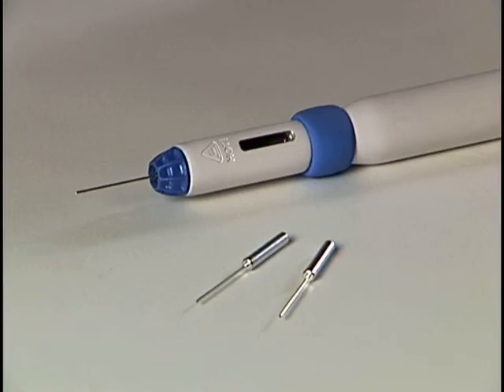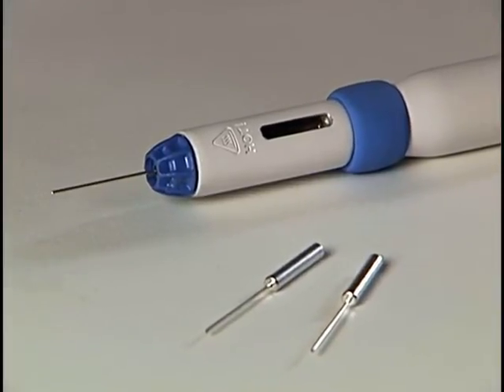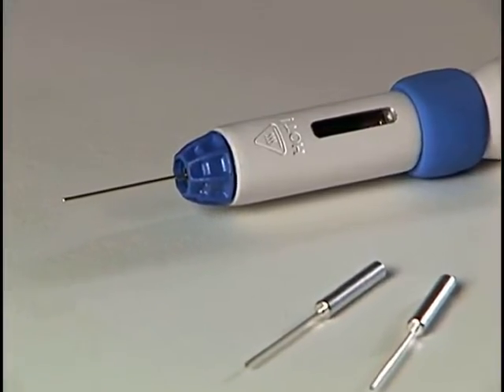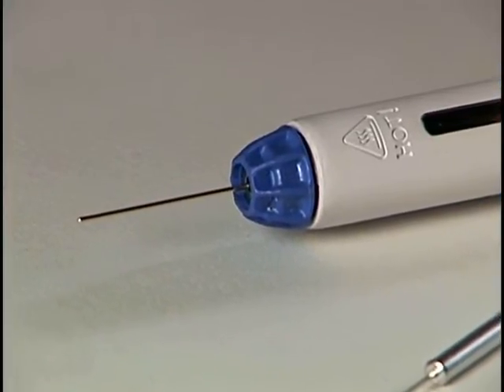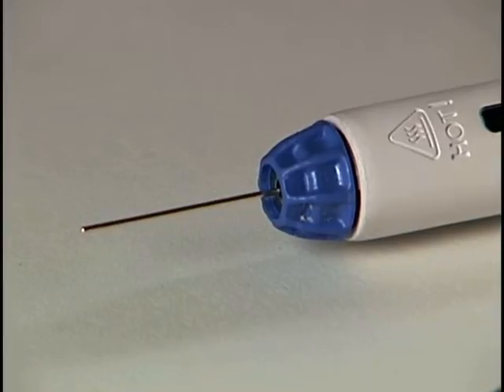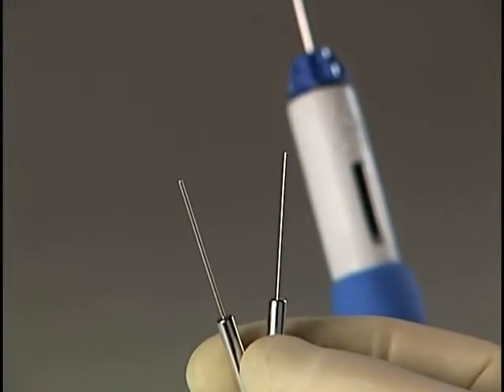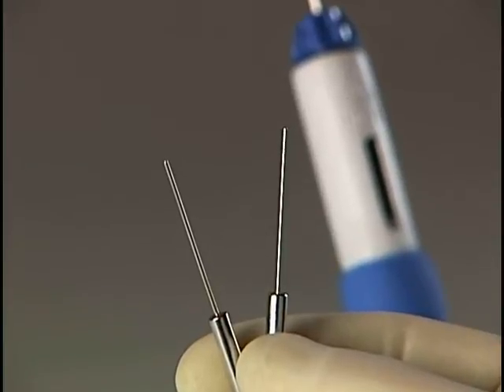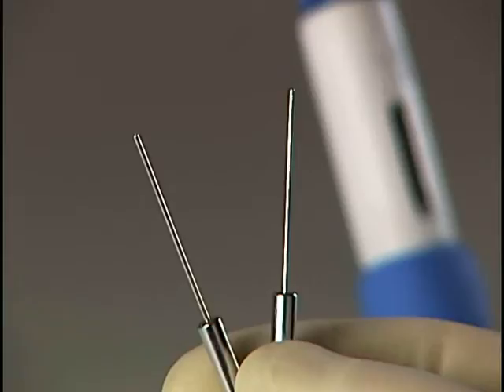There are 2 different cartridges available for the Calamus Flow. Both contain the same amount of gutta percha, about 90 microliters, which is usually enough to fill 4 average to large size canals. Single patient use is recommended. The only difference in the cartridges is the needle tip size. Calamus Singles have either a 20 gauge needle or the smaller 23 gauge needle.